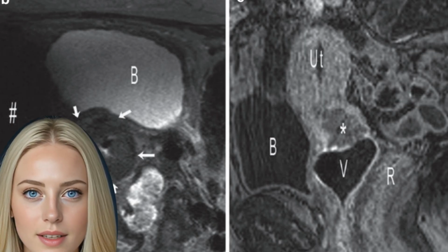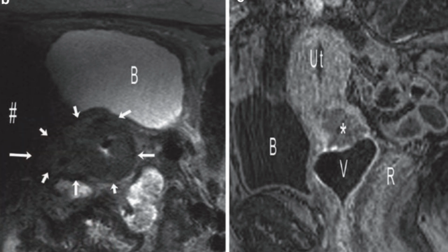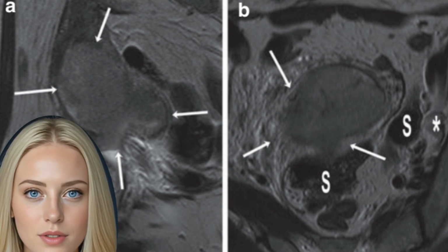Metastases in the liver, the lungs or bones could exist in the advanced tumor stages. For this reason, a complete cross-sectional imaging-based staging including MRI of the pelvis and CT of the body and chest is recommended before treatment. Ultrasound is often not sufficient for a complete evaluation of a local finding. However, this technique is used to exclude hydronephrosis or liver metastases.